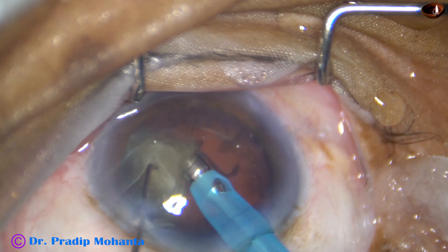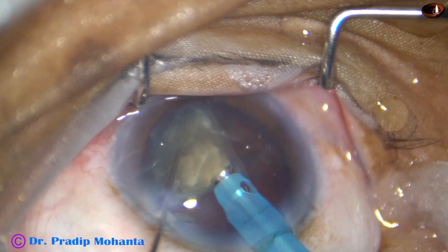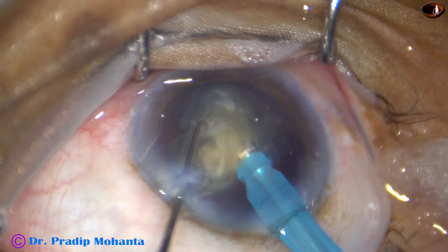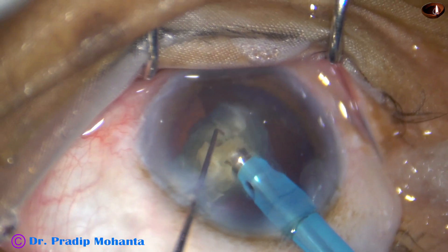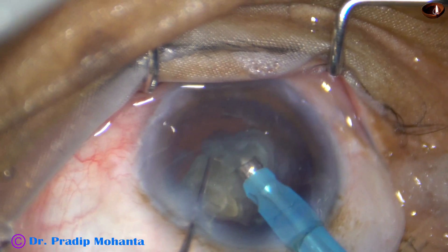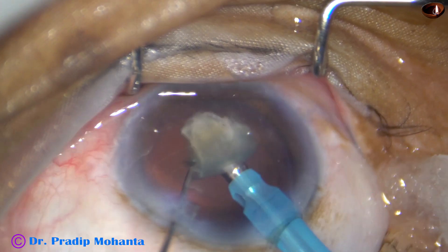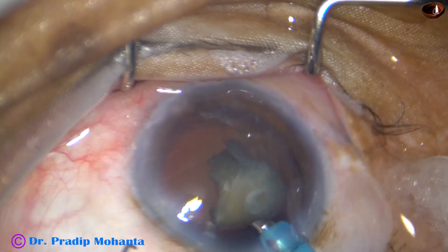This is the last quadrant. At this time I was not very sure about the stability of the anterior chamber because the eyeball is always tending to tilt to the right side. So I just make it small and I leave this small piece and come out.